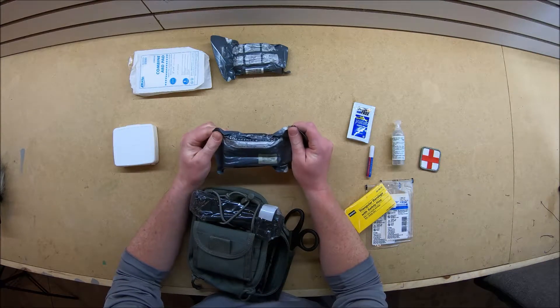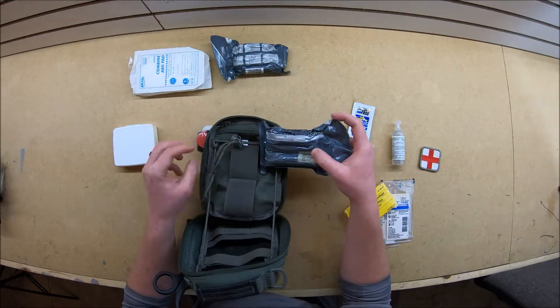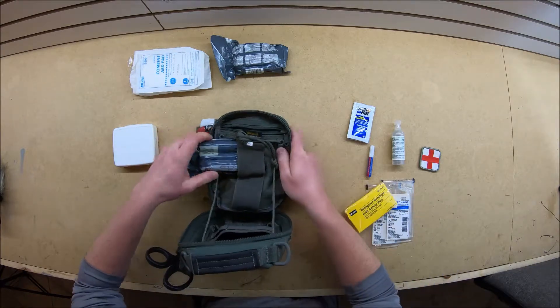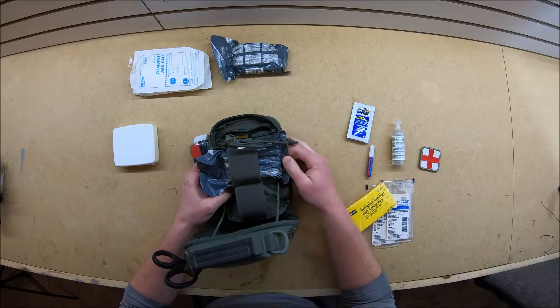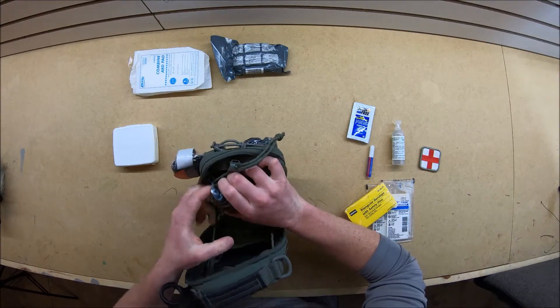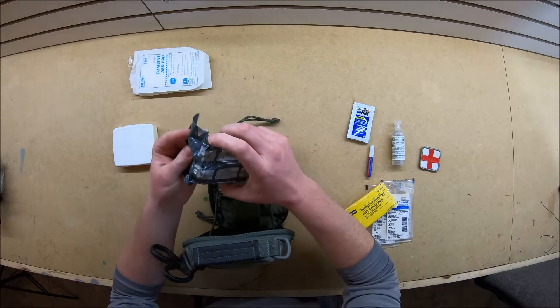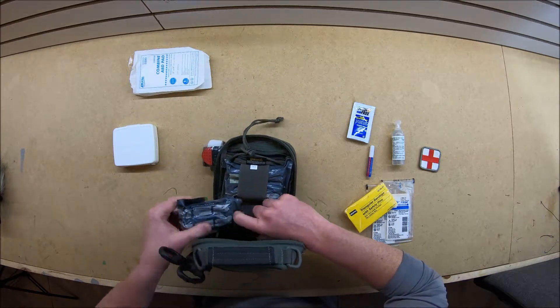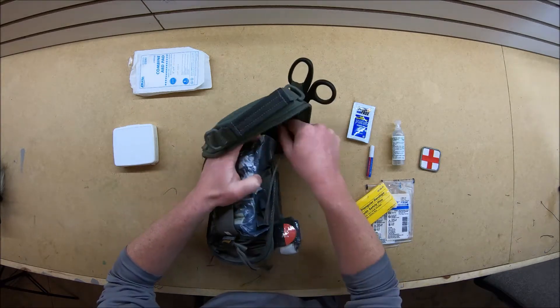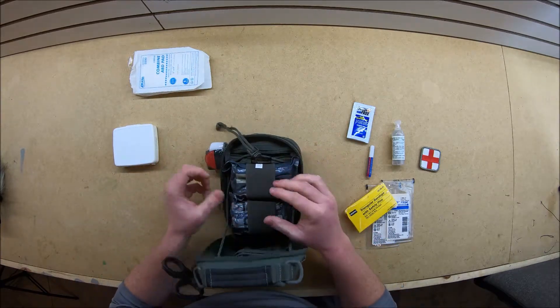I got these large trauma dressings, also called Israeli bandages. This Maxpedition pouch is pretty awesome for this because these guys slip right into these elastic bands right here. Take that and tuck it behind - you got a nice clean little package there. This can easily hold two dressings or more.